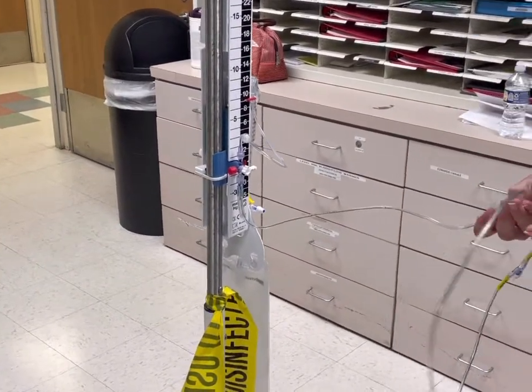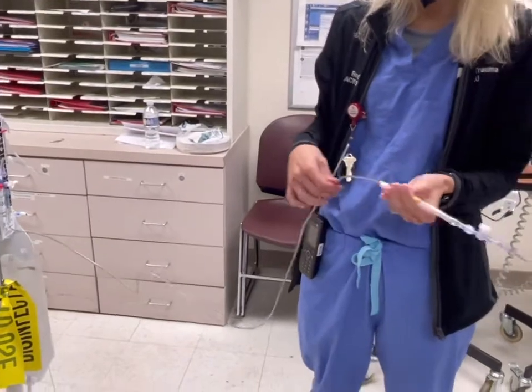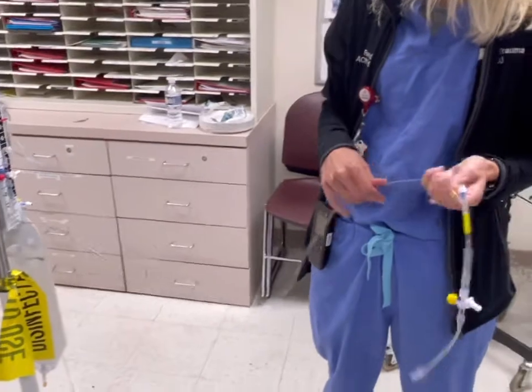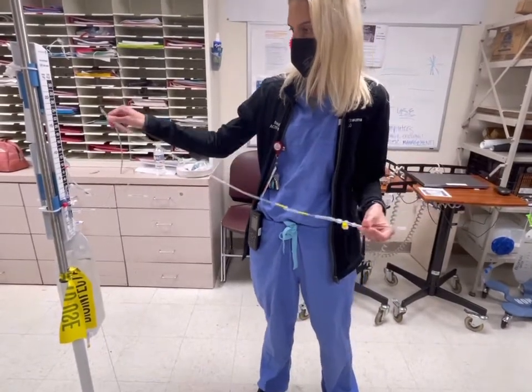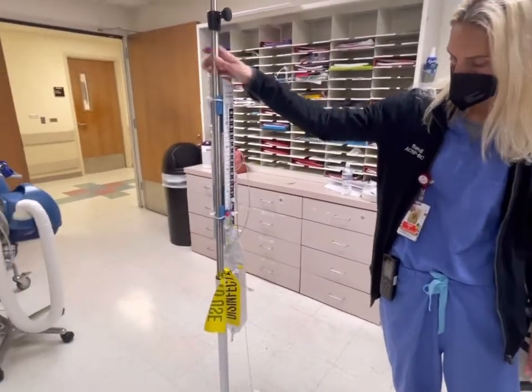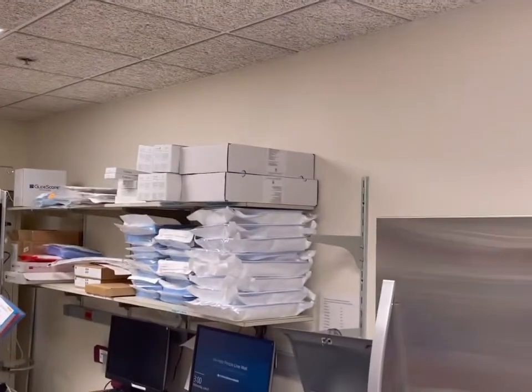Again, it's hard to explain how to use or set up one of these unless you actually do it hands-on. It's almost like an art line, but you have to use very sterile technique with this. So gloves, masks, chlorhexidine preps, sterile saline flushes to connect all this to the draining system when you're connecting it. And then all this setup is back here in the break room on the wall. I think the very top shelves are where the EVD stuff is located.